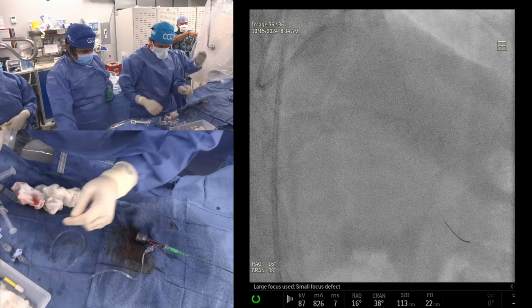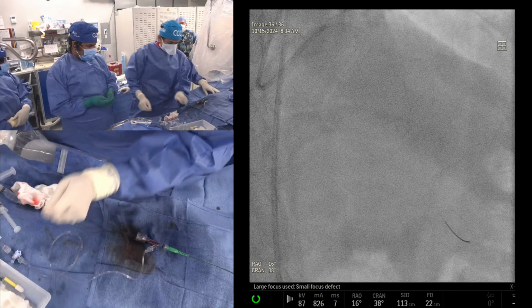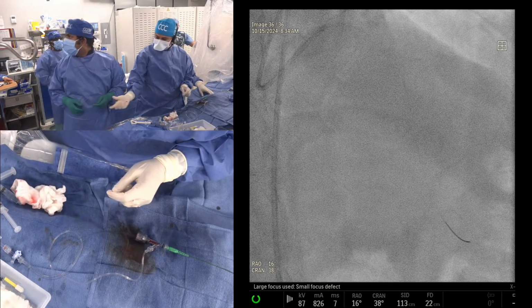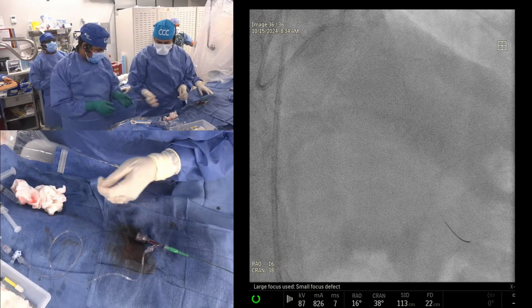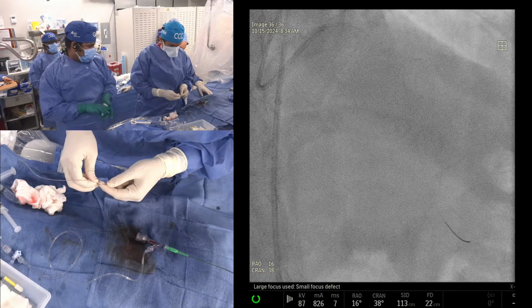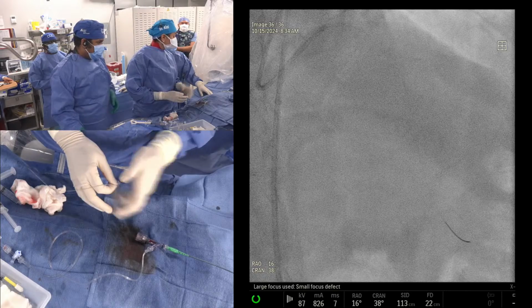And you saw that once not needed, take the contralateral catheter out. Why leave it? If you start having some trouble, a dissection or more so clot, just take it out. So we did it already. We have taken the right catheter out now, the contralateral.